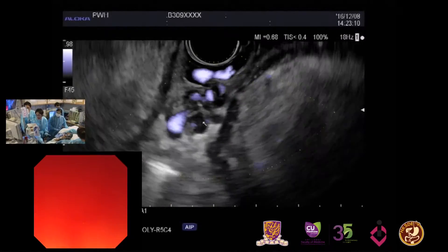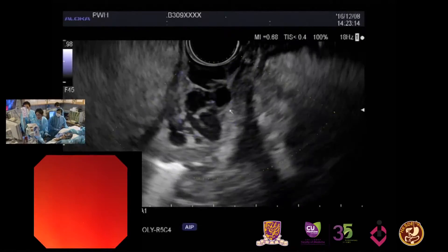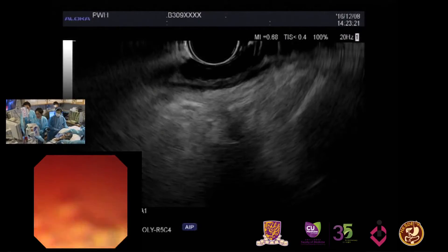Our suspicion is correct. Now we see the gastric varices here. If I move up the scope, we also see esophageal varices. Can you see some big esophageal varices here?